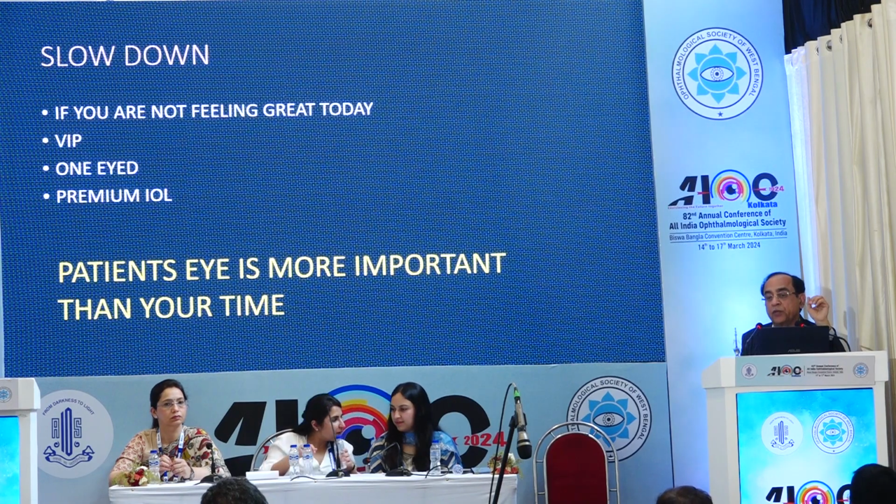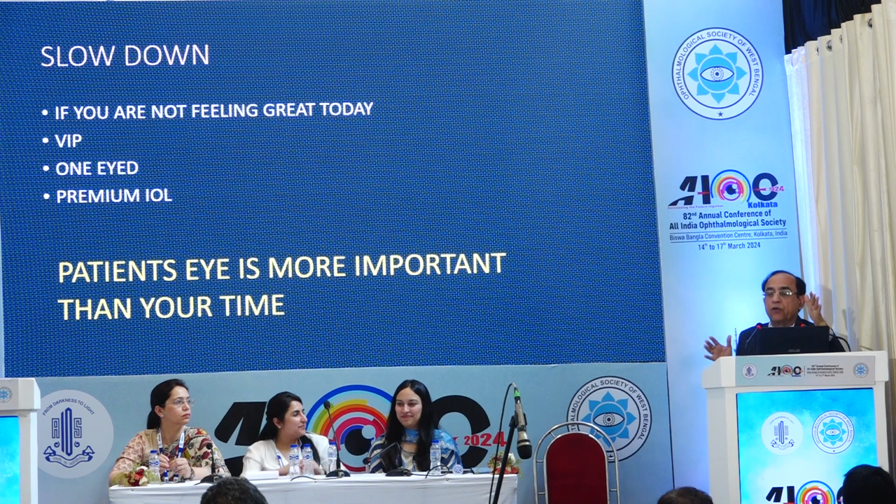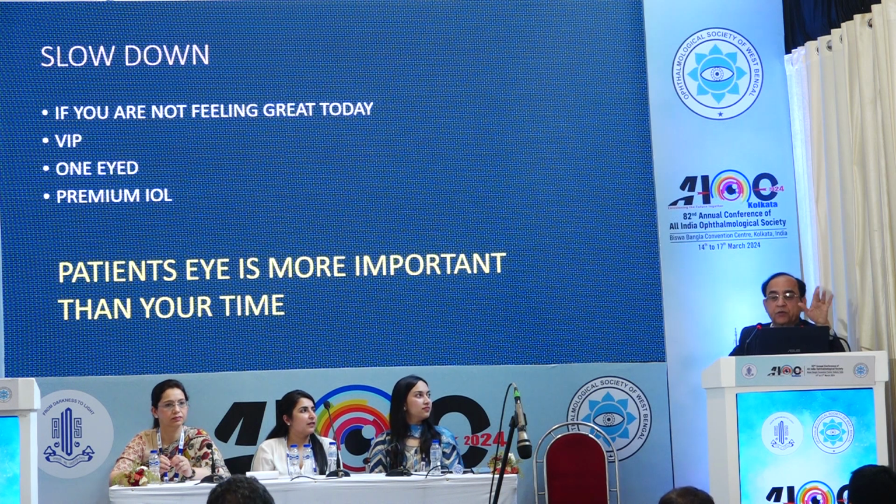Do not try to speed up your surgery. Even I many times have to actually cool myself down when I go to the theater. I know there is a list of 20 cases lined up and I have 3 or 4 hours to operate. Whenever I try to speed up, next day the patients have more corneal edema, 100%. I may save 20 minutes of the total time, or 3 or 4 minutes per patient.